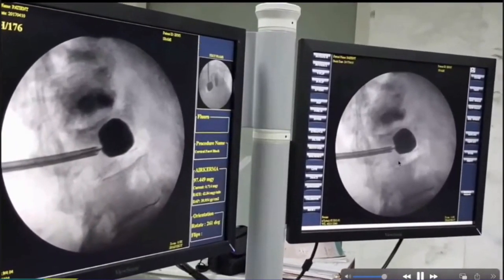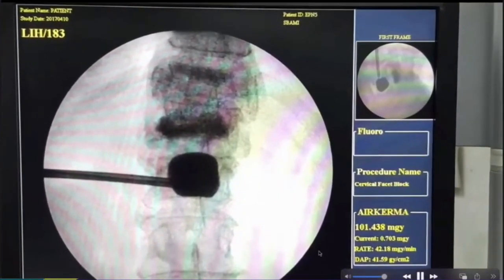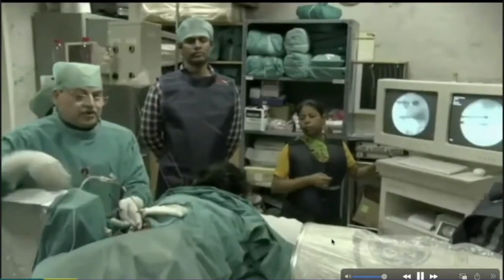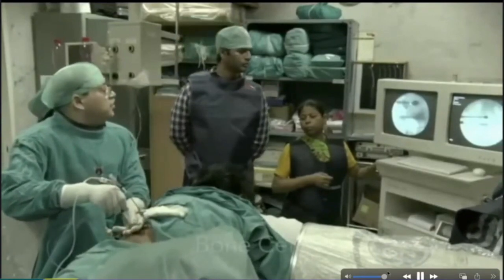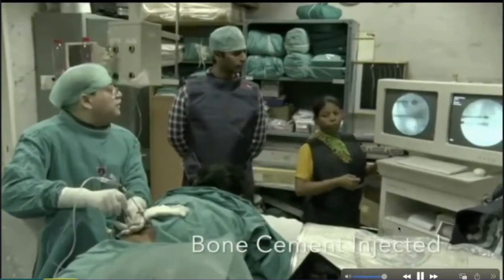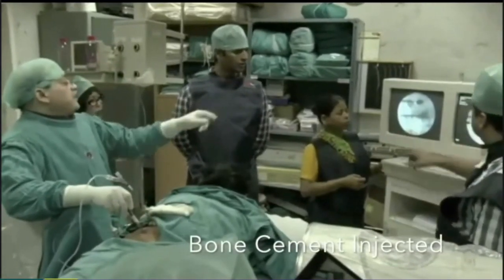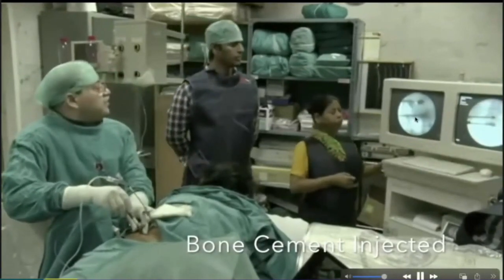If it is an empty bone syndrome, you can inflate the balloon to the last. You don't have to normally, but you can. If that is the case, so I'm putting cement for the vertebroplasty, and I'll be doing kyphoplasty in this vertebra, and that is how it is being injected. So under live, I keep saying, my boy knows it. I don't tell him, but still out of reflex I keep saying live, because I want to see if cement is leaking. This is coming, by the way, in the posterior part, but again, I'm at the anterior margin, so I really know it is basivertebral.